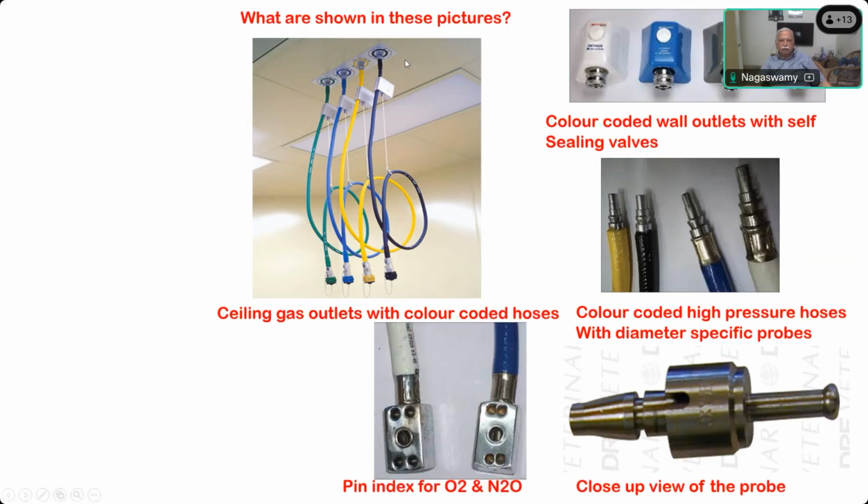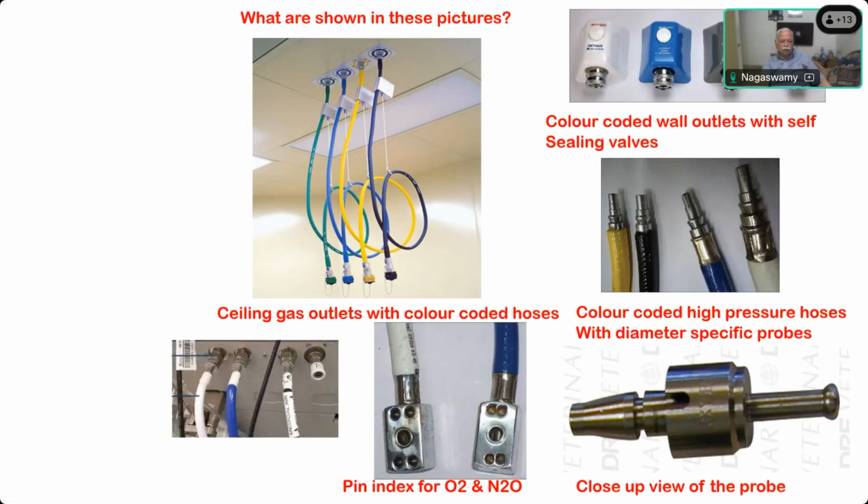Okay, so this is the pipeline delivery outlet, and then the whole thing goes to the machine where it will be fitted. Which portion of the machine will hold this? What is that portion called? The anesthesia machine, where you insert this block and then fit it so that the gas comes through. This is the hole for the gas to come out. Which part of the anesthesia machine is this fitted to? It's called the hanger yoke assembly. Okay, you will see the picture here soon.